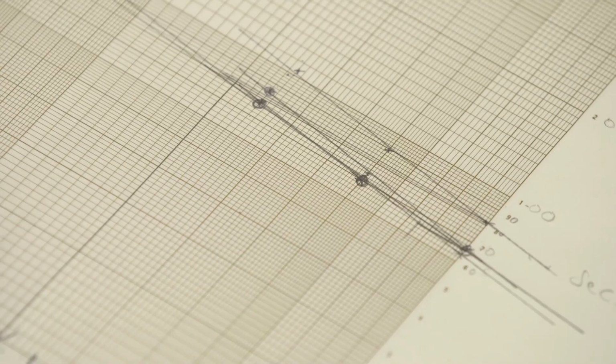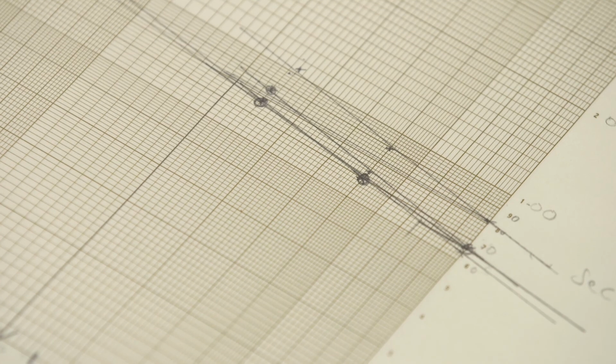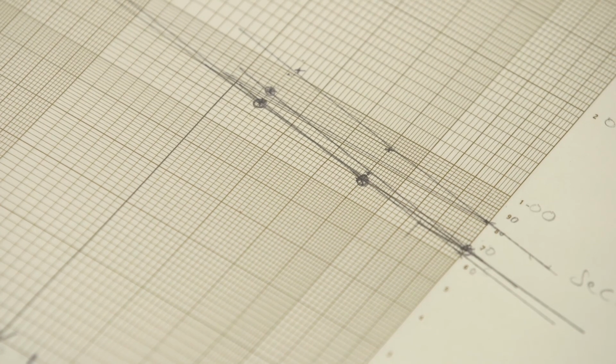As we progressively dilute, 1 in 20, 1 in 40, it's a feature of lupus anticoagulants that we begin to lose that inhibitory effect, and the false prolongation is less prevalent at these higher dilutions. So we move in the higher dilutions closer and closer to the truth, to the real answer, to a clotting time unaffected by this interference. The maximum interference is in the least diluted sample, the 1 in 10. So this does not meet the criteria for a valid assay.